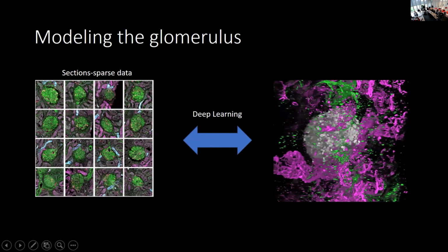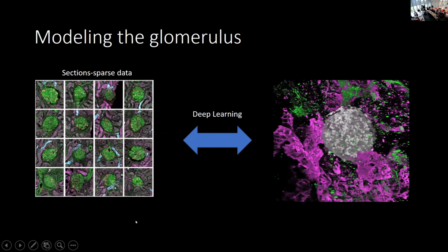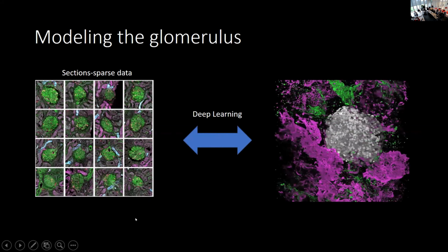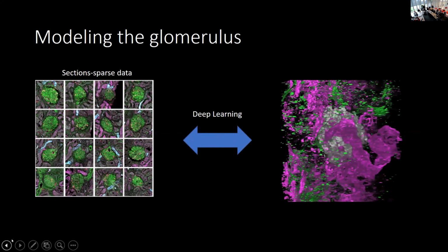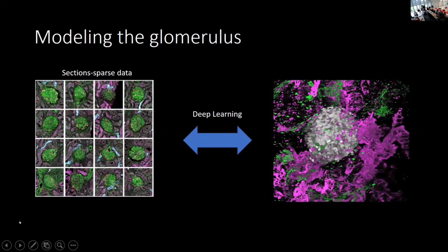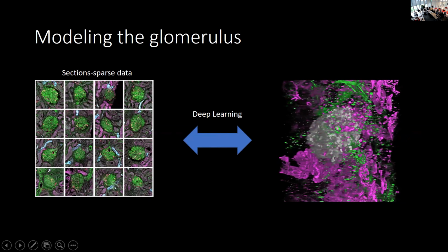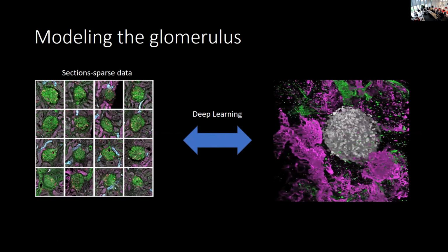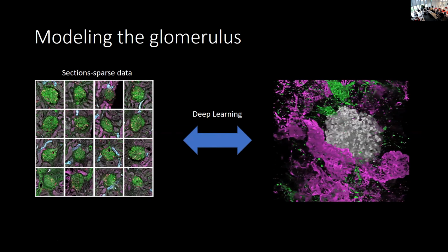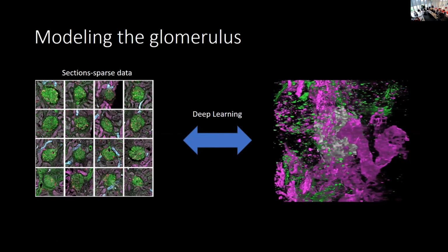We're using a similar approach, and then using a number of deep learning strategies, trying to figure out the most representative way to take that sparse data to build up those specific models. Again, we envision that, at least in the beginning, being a reference, but as we move in the KPMP program to either AKI or CKD, also developing models for those particular pathologies, disease states.